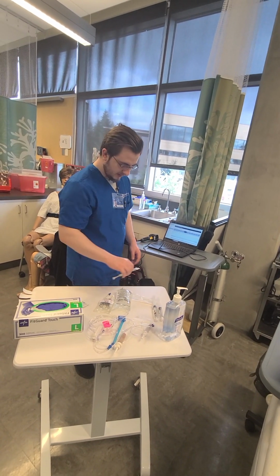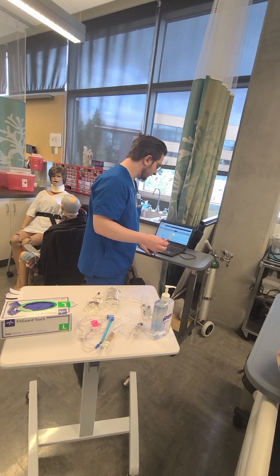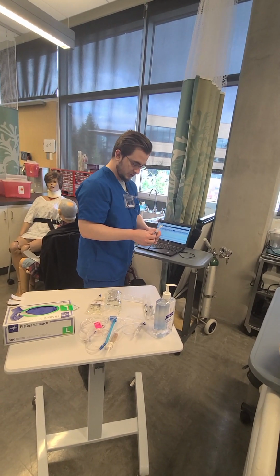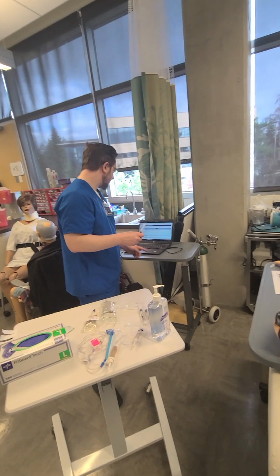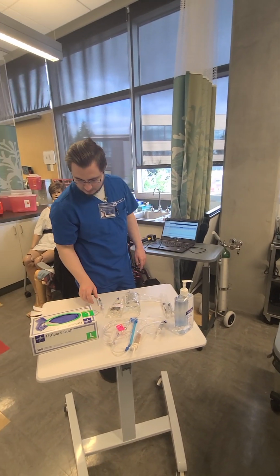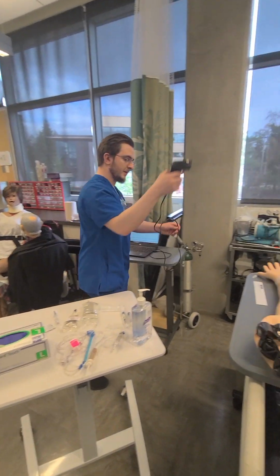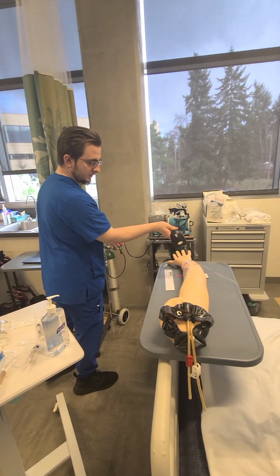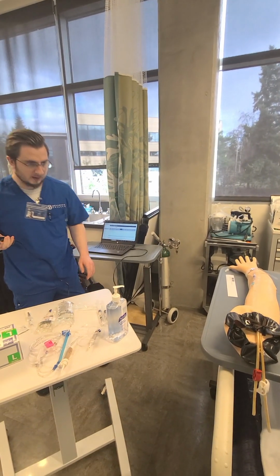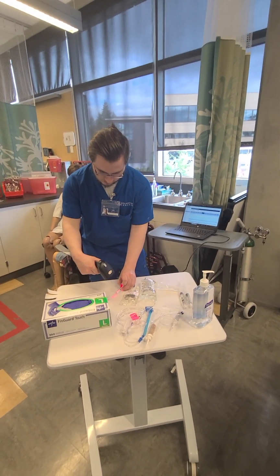Same with my Zofran. It is 4 milligrams in a 2 milliliter syringe. It is the right patient, obviously Erica. It is the right medication, Zofran. It is the right dose, 4 milligrams. It's the right route, IV push, and right time. It is due now. I have all that. Can I get your wrist real quick? I'm going to scan you in, and then I'm going to scan both these meds. All right. It's not working right now, but it will work. Scan that in. I scan in my Cipro. I scan in my Zofran.